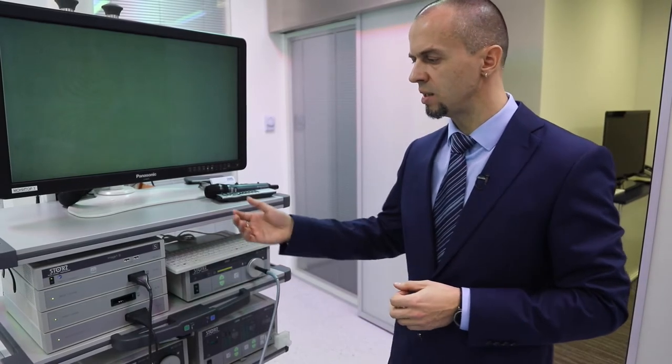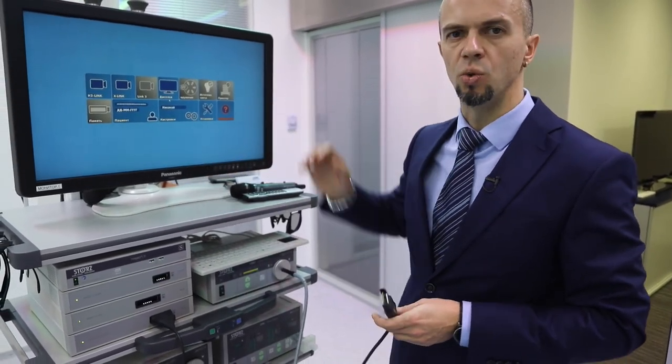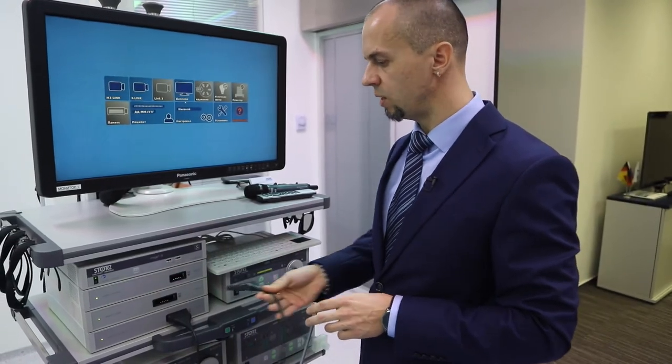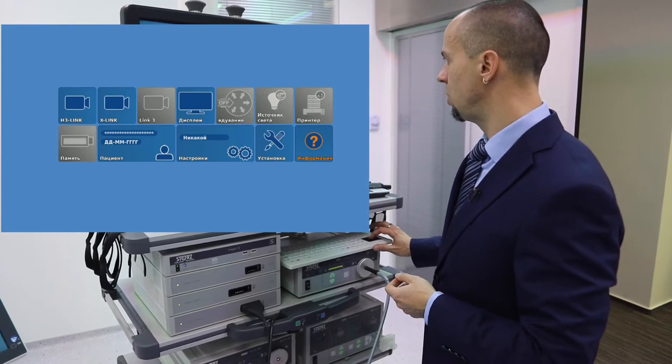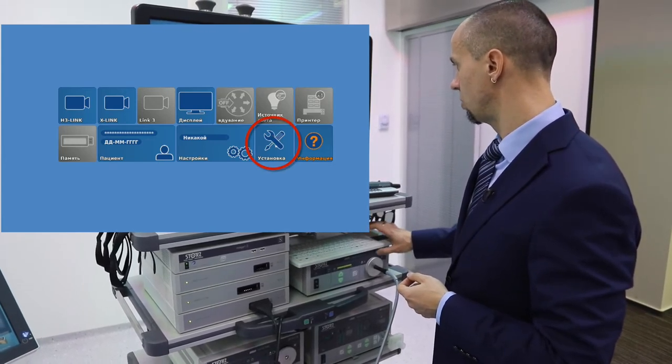Далее нам необходимо провести первые предварительные настройки. Для того чтобы, например, перевести систему в русский язык, необходимо зайти в глубокое системное меню. Сделать это можно, отсоединив головку камеры и убрав источник видеосигнала. Мы оказались в первом системном меню, откуда будем делать главные начальные настройки. Находим меню «Установка» и заходим в него.